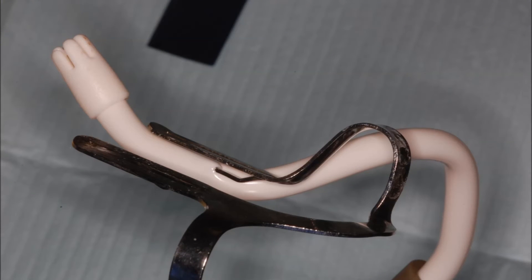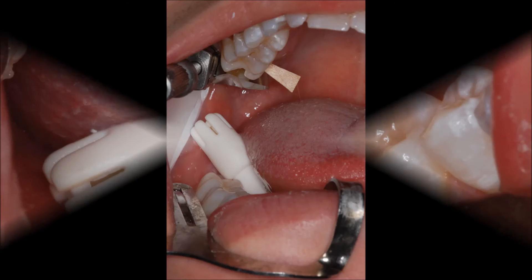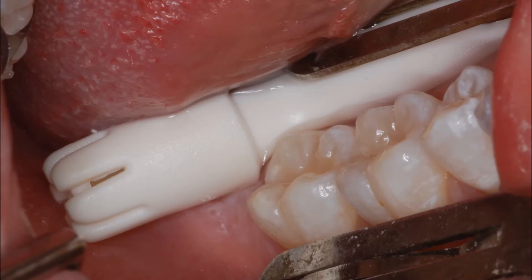Setup for isolating upper molars. The tip of the saliva ejector is elongated further on the Garmer's lingual holding tine and bent toward the distal of the upper molar. The Garmers secures the tongue while the saliva ejector and the buccal neo-drys keep the field free of moisture throughout the restorative procedure. This is a close-up view of the saliva ejector tip extending behind the molars and removing the tongue from the operative field.